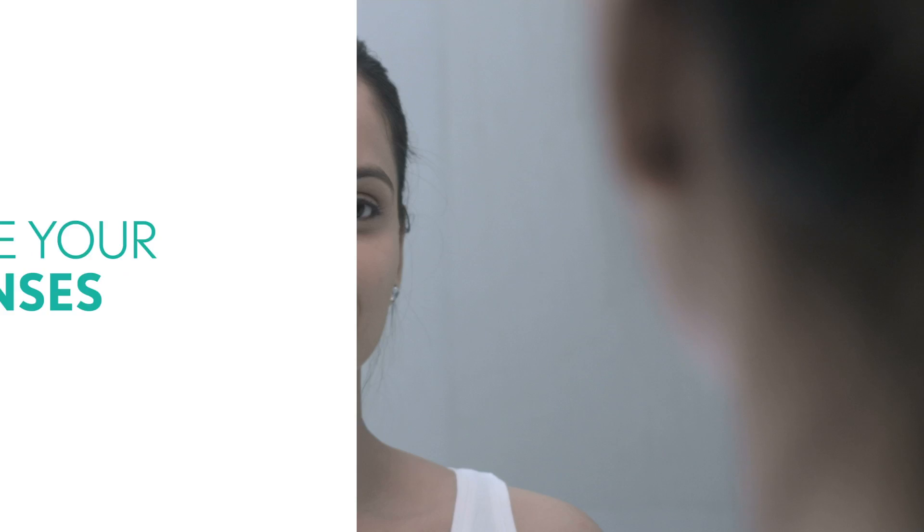It's very easy to take off your contact lenses. Just make sure you have washed your hands before and dried them with a lint-free towel. Now fill the lens case with Bio True solution, look up, and pull down your lower lid.